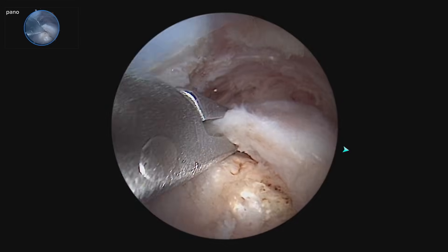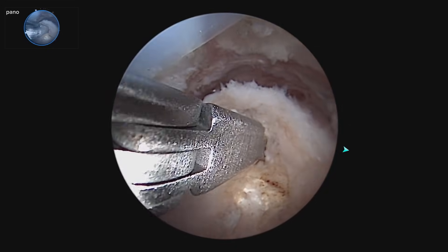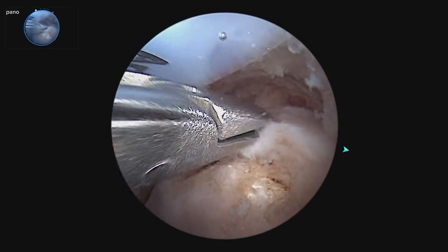This is a left shoulder and we have a small laterally based tear. We are going to plan to put one anchor here and one anchor here right on the edge of the greater tuberosity. We are going to repair that in a single row fashion for this case.